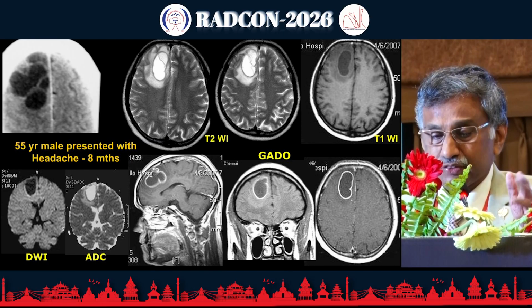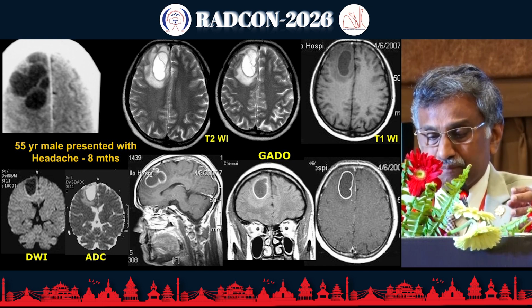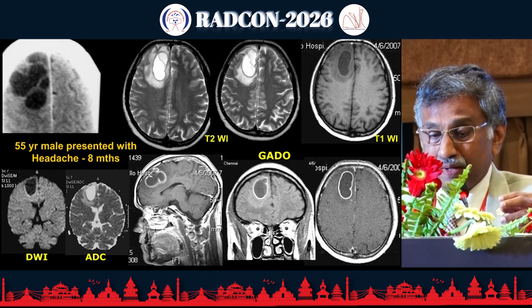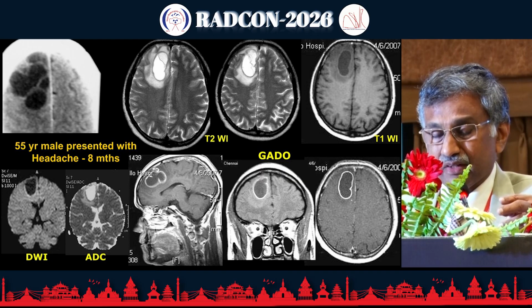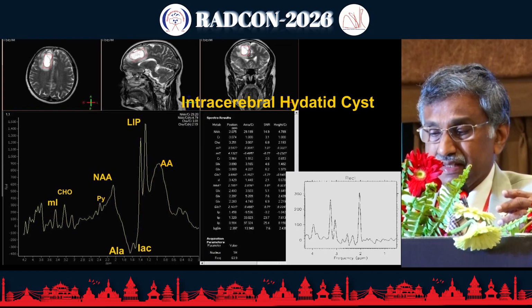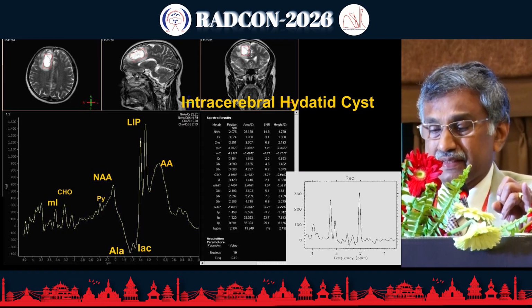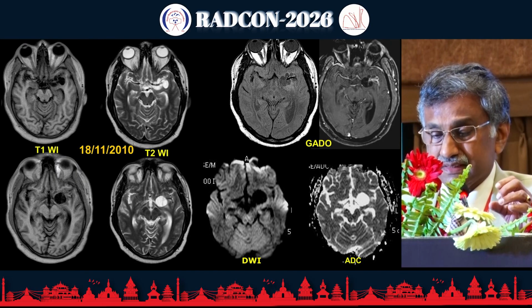This is a 55-year-old patient with a headache, and MR spectroscopy showed alanine, more importantly pyruvate, and a lactate peak and amino acids peak. The combination of all three confirms an intracranial hydatid cyst formation. Pyruvate is one of the markers of parasitic etiology.